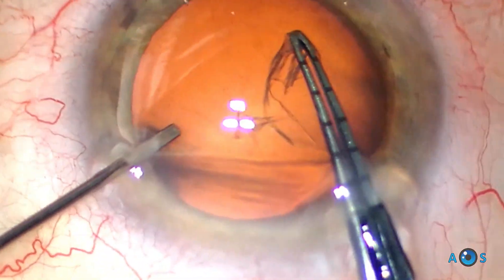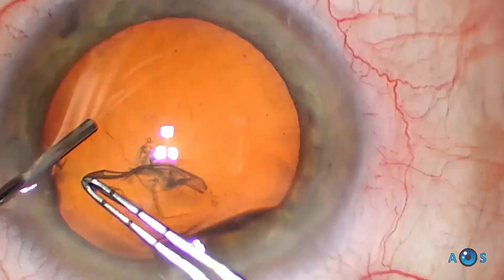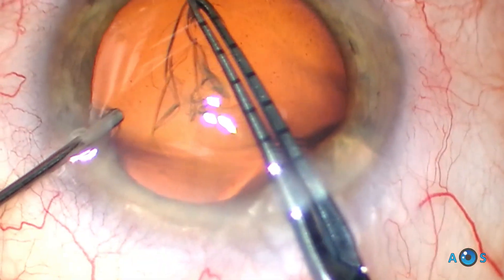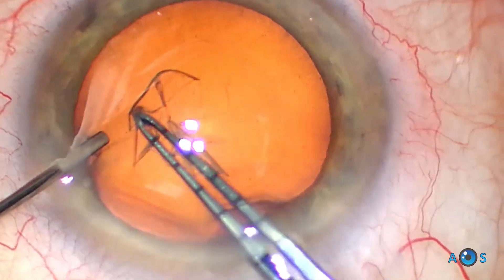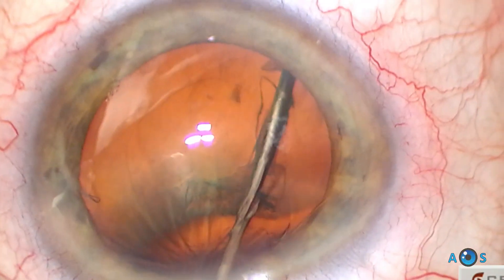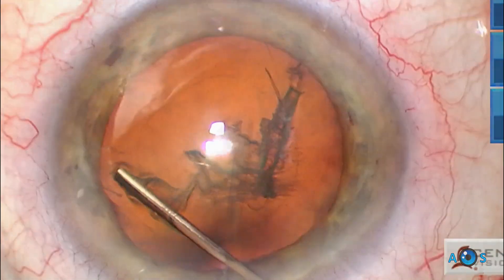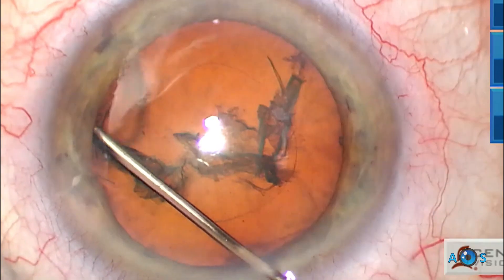As will be shown in this video, one of the main differences in this machine is that it operates around the concept of setting an intended intraocular pressure. The BSS flow rate and aspiration are controlled in order to maintain the desired IOP level constant. This minimizes anterior chamber instability, allowing a safe and controlled FACO emulsification.